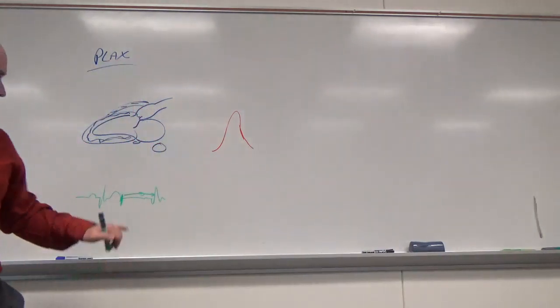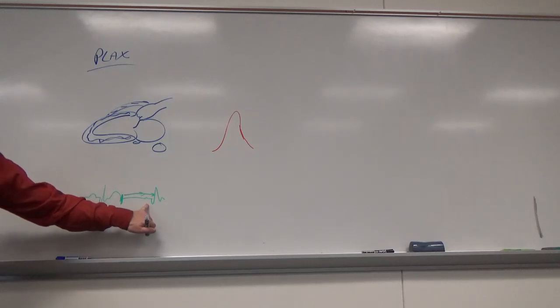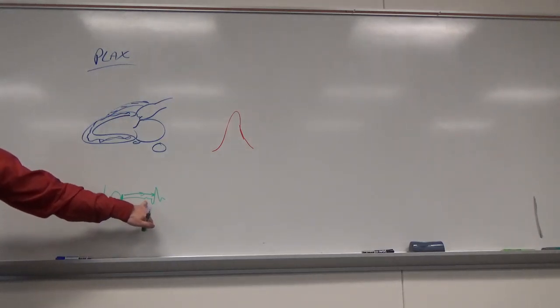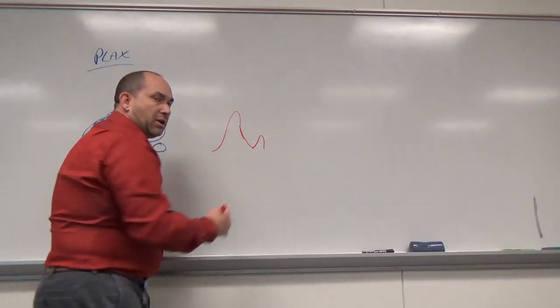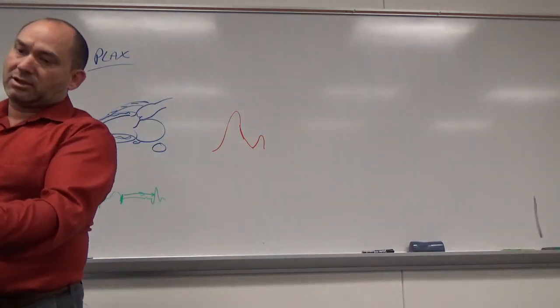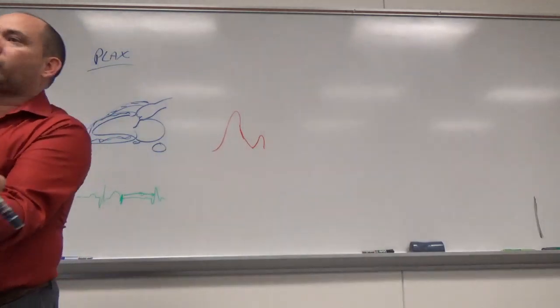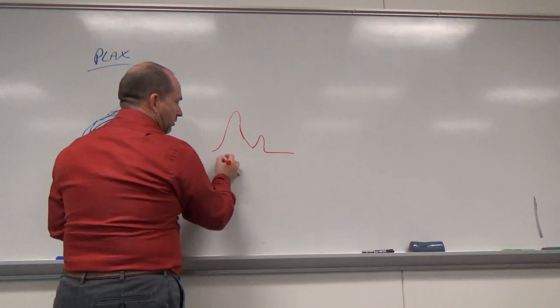what happens on my EKG? So there's diastole, the valve opens here, it's going along. I get to this point here, that's what? This is atrial contraction with the P wave, or just after that. Then I get an atrial kick, which gives us a little bit of extra blood pumping out because it's been filling more. And now that little kick of the atria squirts out the last remainder that it can. And then it goes back down to baseline.